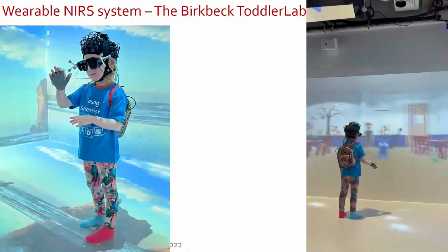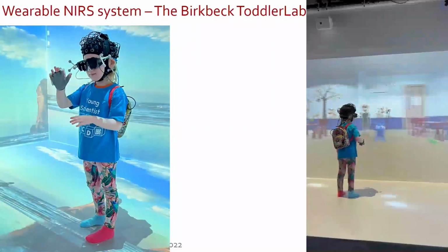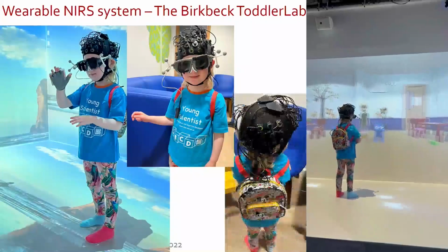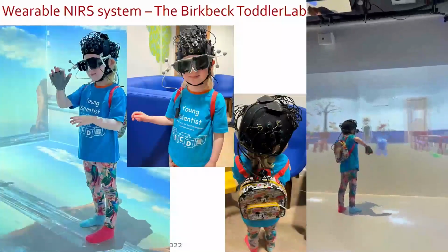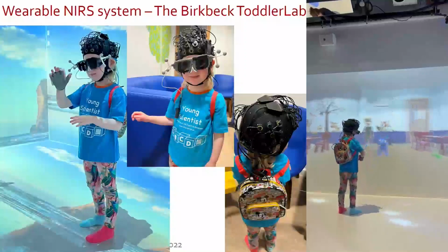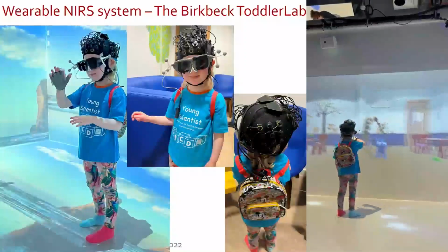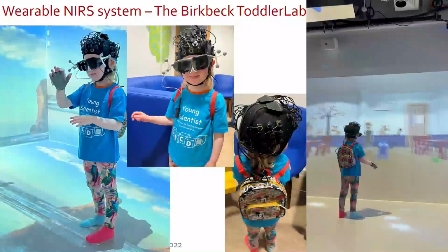So that's super cool. And this is literally the equipment she had on. Again, she tolerated that very well. So the cap with the glasses, with the eye tracking embedded, and the little small gray balls that you see are the motion trackers, because we have motion cameras to detect where she's moving. And the whole NIRS system is basically very small, like this big, embedded in the backpack.